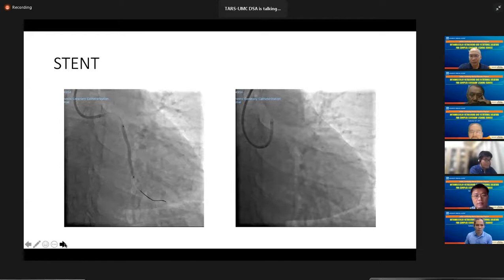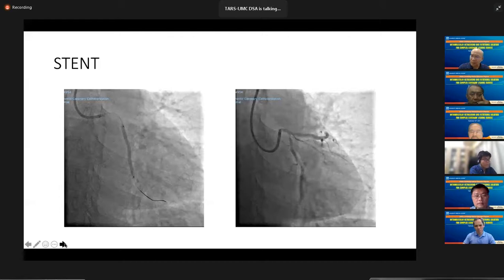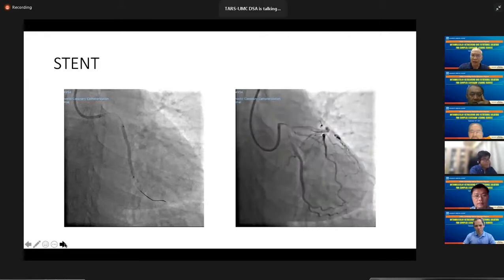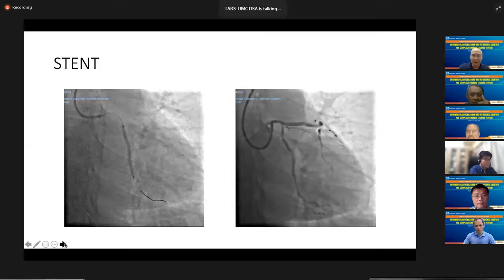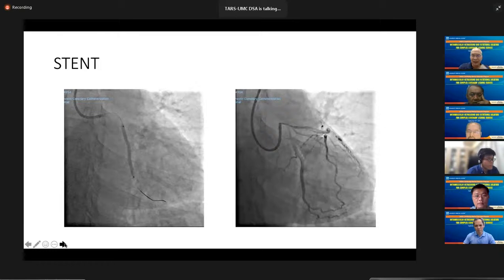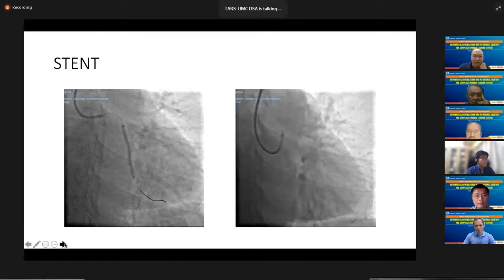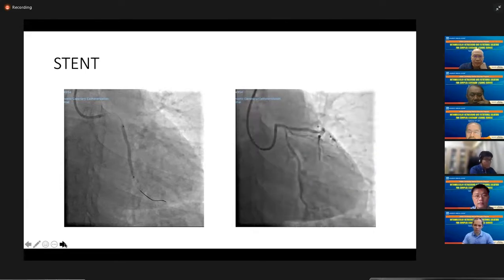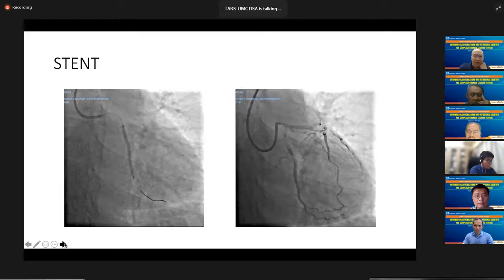Today the patient has persistent stable angina with CCS grade 2, and with the previous coronary angiography, we think the lesion is the left main and bifurcation. What is the next best step for management in this situation?